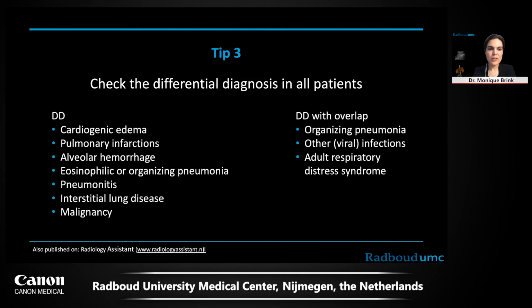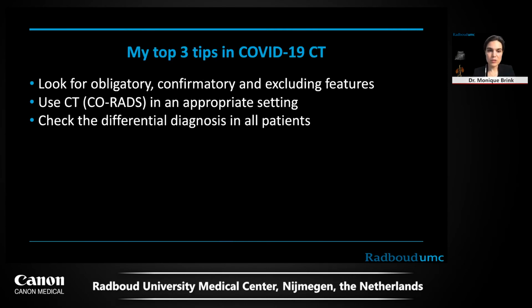So that's my final tip. Check the differential diagnosis in all patients. You have some easy ones, you have some important pitfalls to exclude, but you also have problems or diseases with significant overlap in imaging features, and you have to be aware of that and take them into account. So these are my top 3 tips in COVID-19 CT.